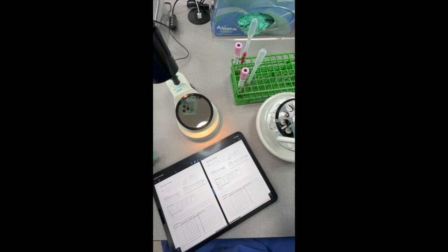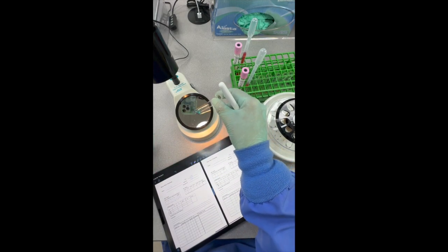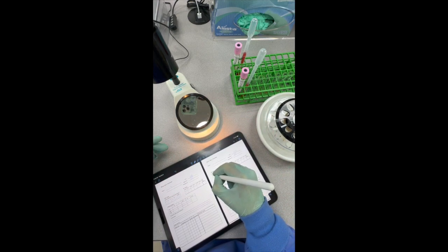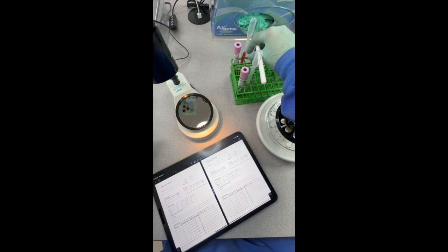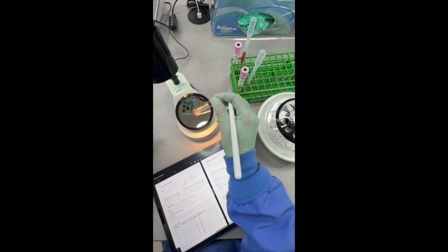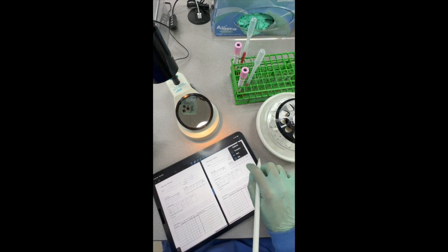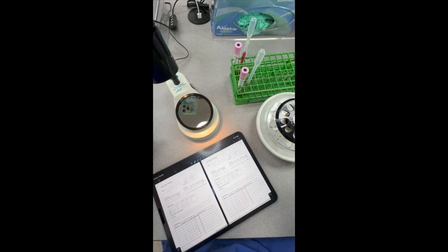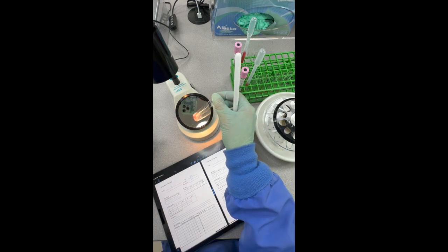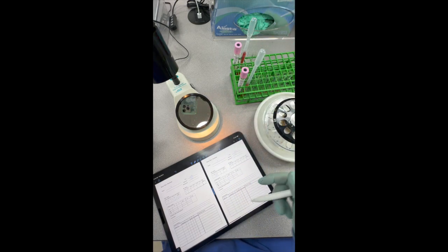This is patient C, and you can see our worksheet there has C on it. We're going to look at this, and we have a nice 4+ reaction for A. And we have a nice negative reaction for B. We want to tilt it, see that streaming off of there. Looks good. We'll go ahead and look at our D. And again, we have a negative reaction here. Okay. So we'll just sit that in our rack for now.